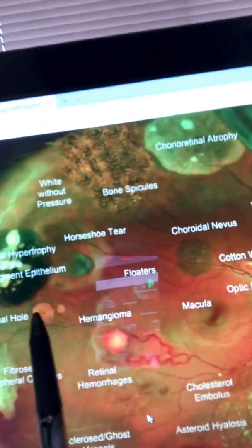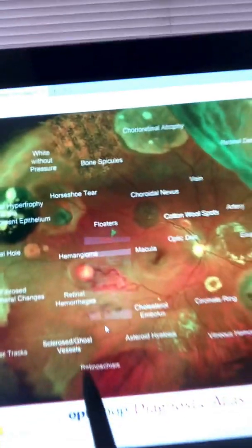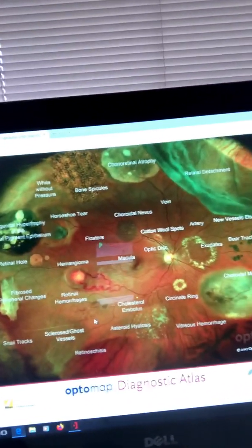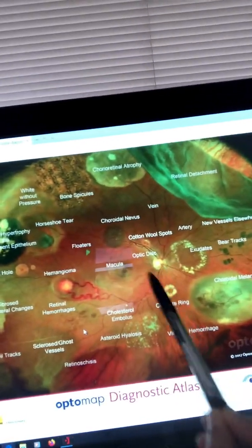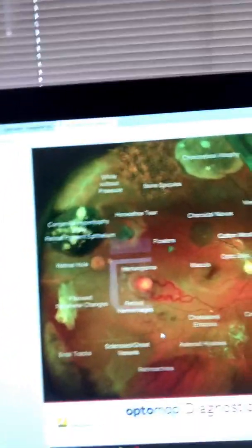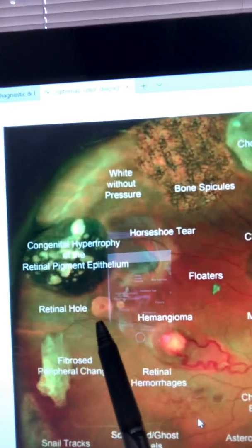Here's another important one — the retinal hole. And as you can see, if the pupil was not dilated, I wouldn't be able to see all these things. The pupil is tiny; I would probably only be able to see the optic nerve area. But these findings can happen in the far peripheral part of the retina as well. This retinal hole needs a consultation with a retina specialist.